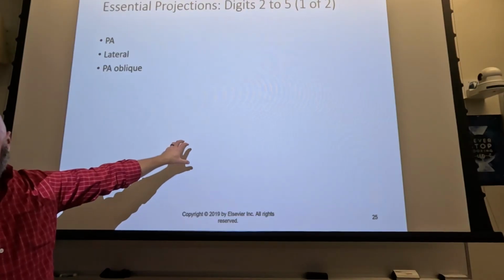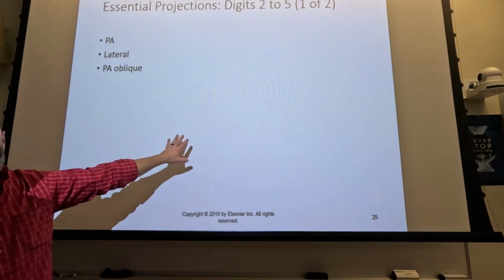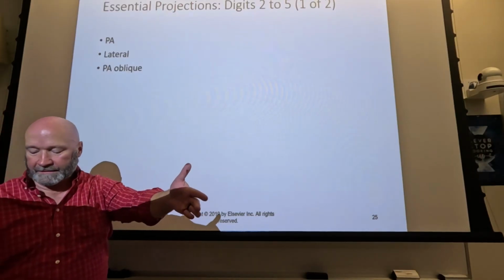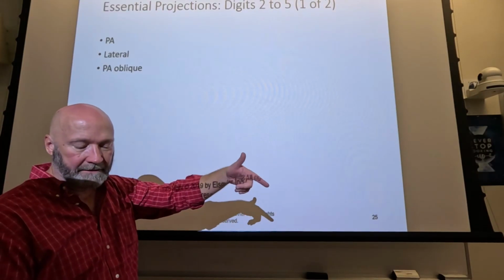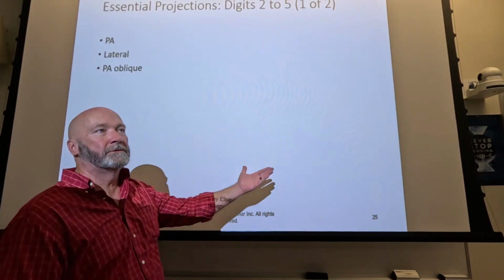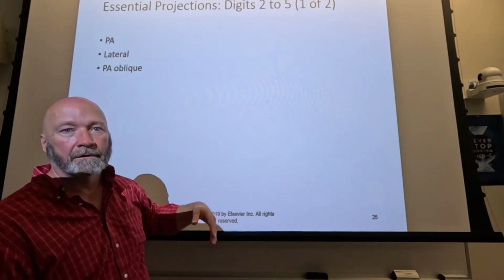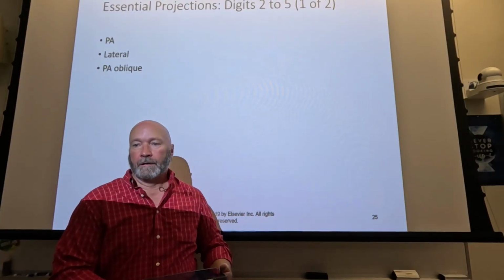Arched with the fingers resting on a sponge? No, and I'll tell you why in a minute. Or rotated internally with the digit extended. I think the best answer is rotated internally with the digit extended. I think that's better than rotated medially, because even though you're rotating towards your midline, it's still towards the lateral side. So I think that's your better answer. What's that? Because of the thumb being lateral? Yeah.